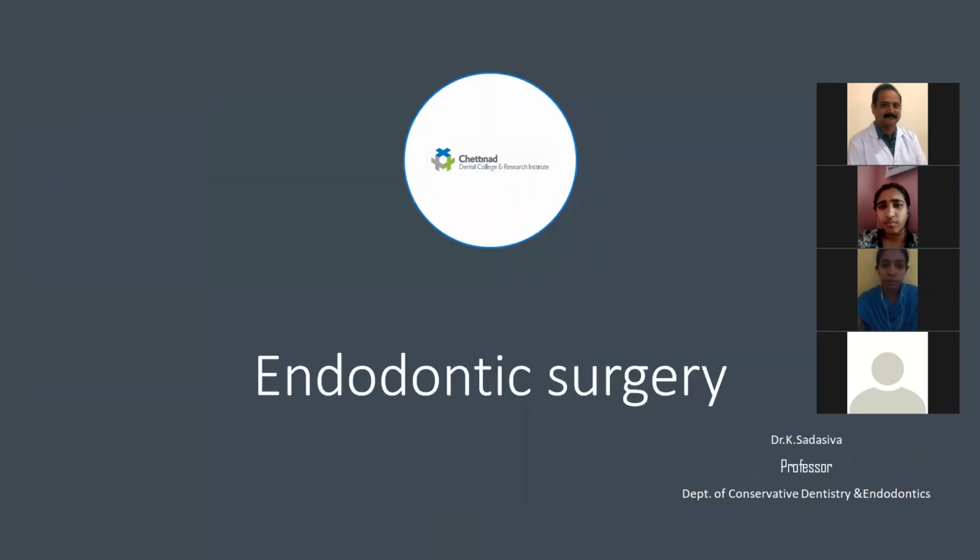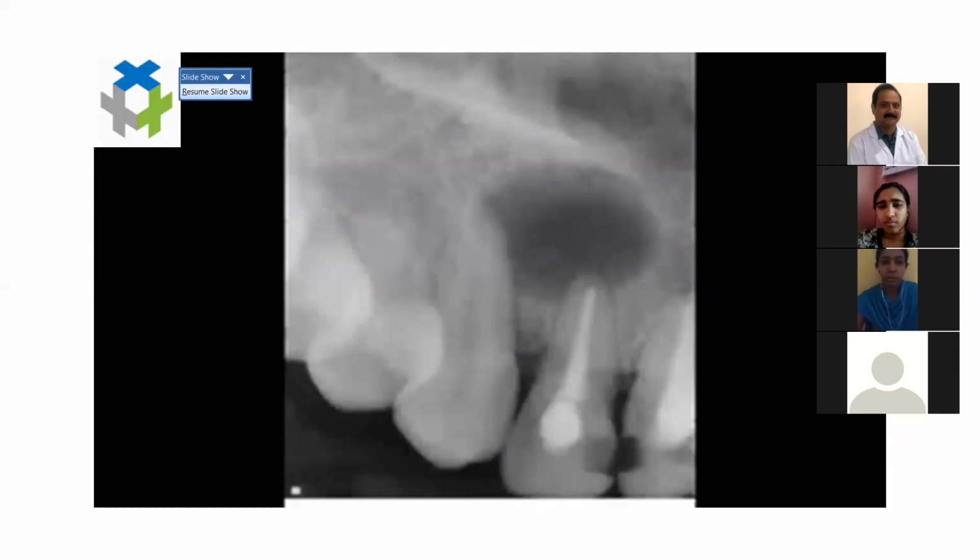So I will go to the salient features of endodontic surgery. You can see this X-ray already. It's got a sufficient amount of root canal filling, but still there is a cyst. So this may be a case that can be considered for periapical surgery.